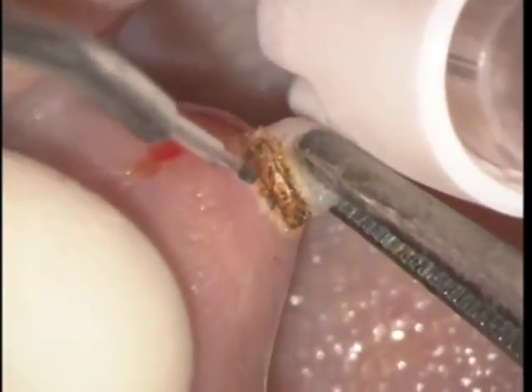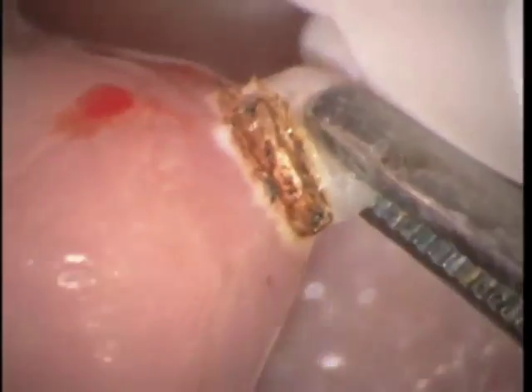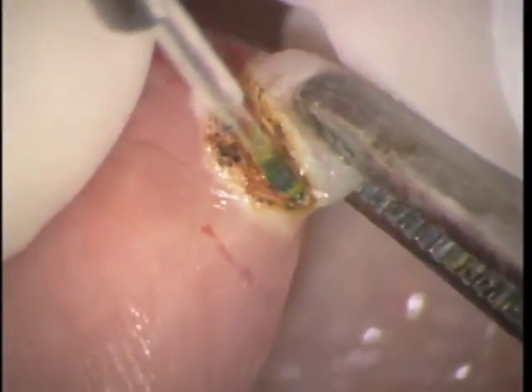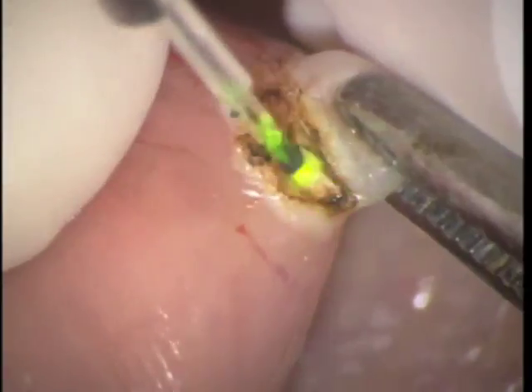If you want to up the energy you can do so, but if you were to use higher energy the fear is that you may really cook the tissue and when you send it in for biopsy it's difficult for the pathologist to read.